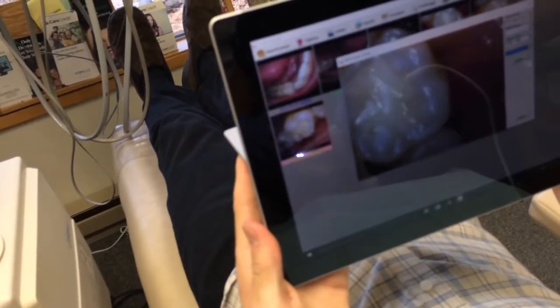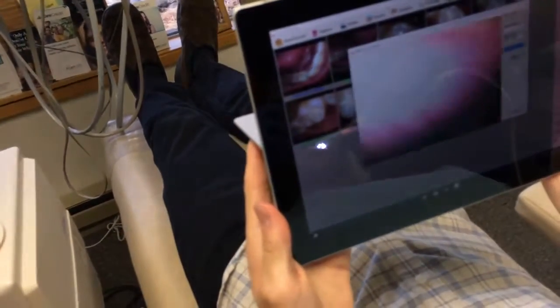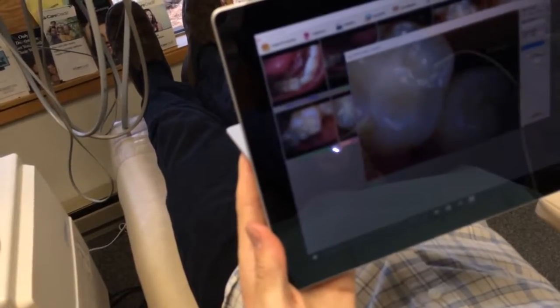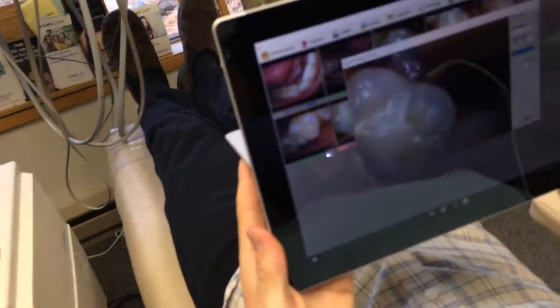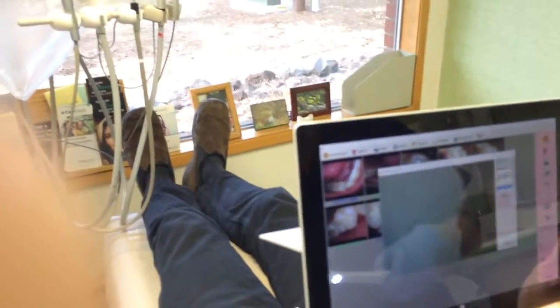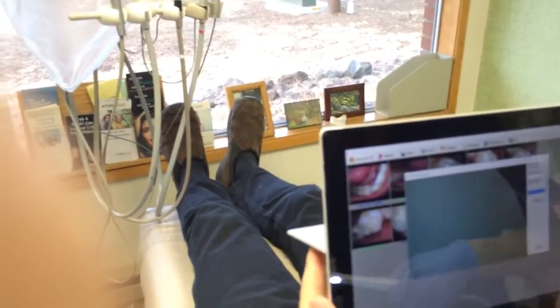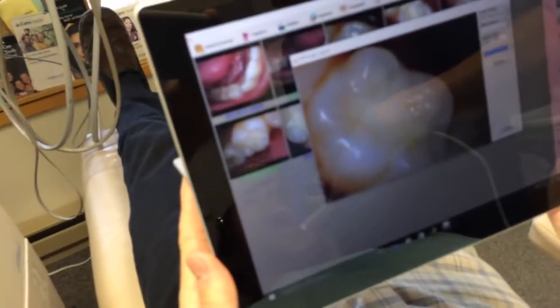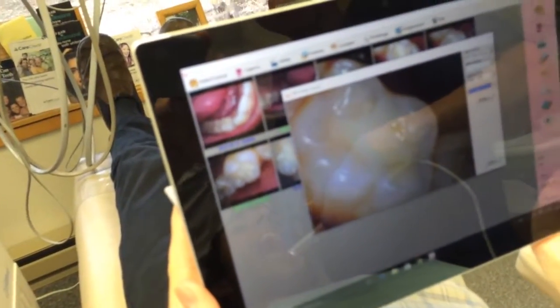Basically, I want to show a crack. I want to be able to show the crack details of the teeth. One thing we might add is to take your air, not your air water, but air, and blow off the teeth first, so you don't have slime and water bubbles flying. See right here, I've shown it pretty well. Yeah, that's pretty good.